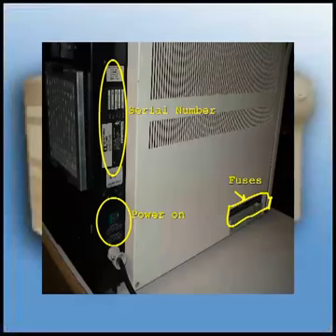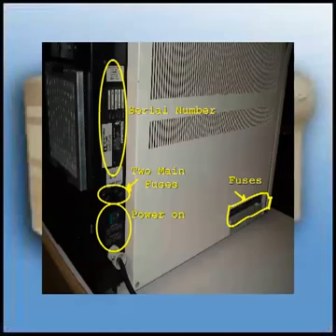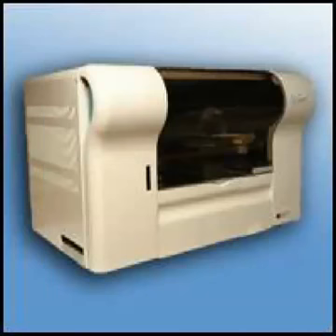On the left side, you are going to see the fuses on the bottom front, the power on switch, and the two main fuses. This is also where the serial number to the instrument is located. That concludes the introduction to the operator training session. Thank you very much for your time.